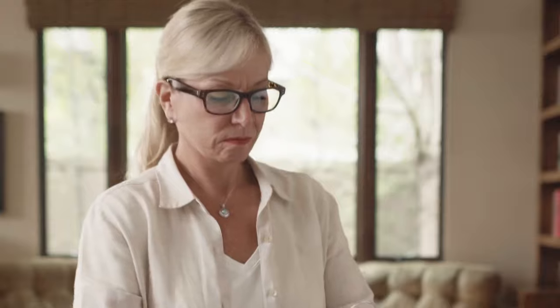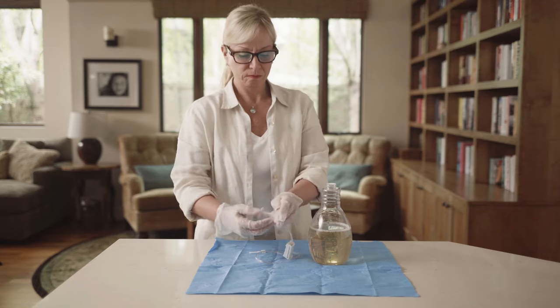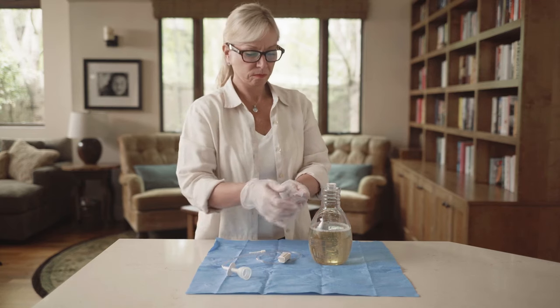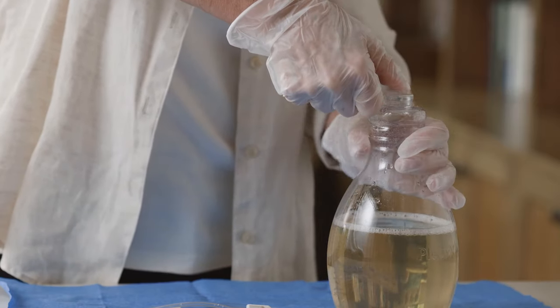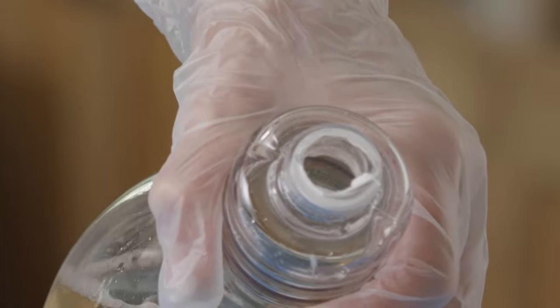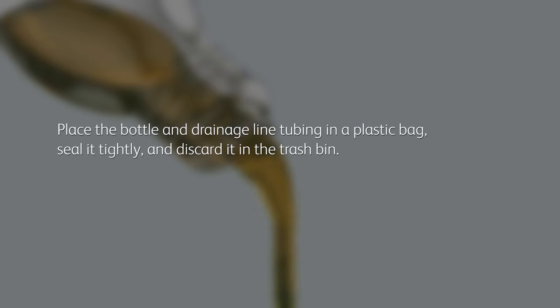To empty the bottle, remove the bottle opener and flexible cap by placing your thumbs under the rounded end of the bottle opener and firmly pressing up. Remove the bottle opener from the drainage line by squeezing the flexible cap and pulling it through the bottle opener. Use the bottle opener to create a larger opening in the foil seal by firmly pressing the pointed end into the foil seal and rotating the bottle once inserted. Empty the bottle into the toilet or sink, then place the bottle in a plastic bag, seal it tightly, and discard it in the trash bin. Used Plurex bottles cannot be recycled.